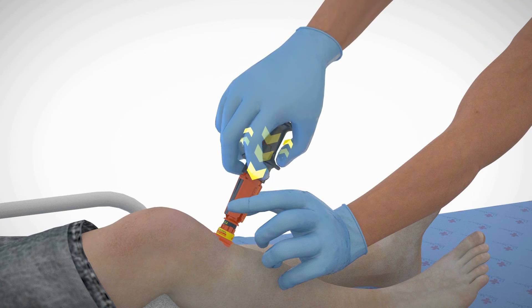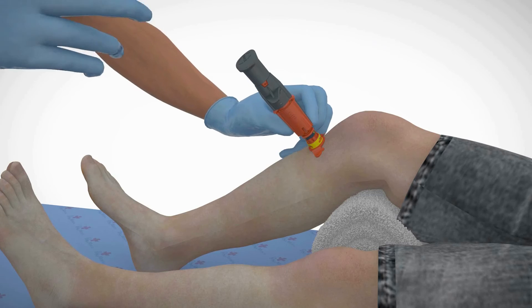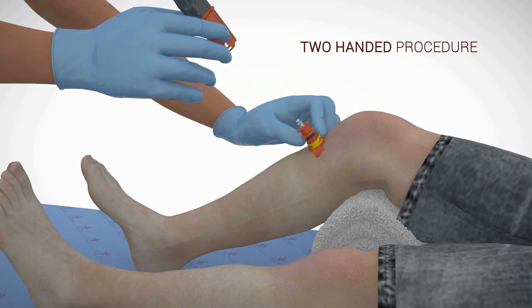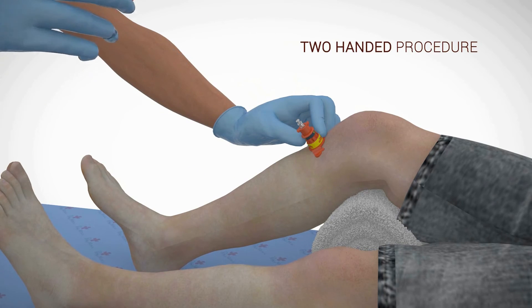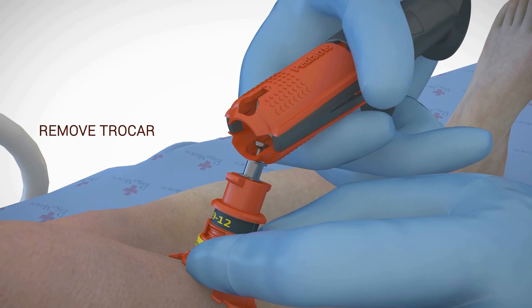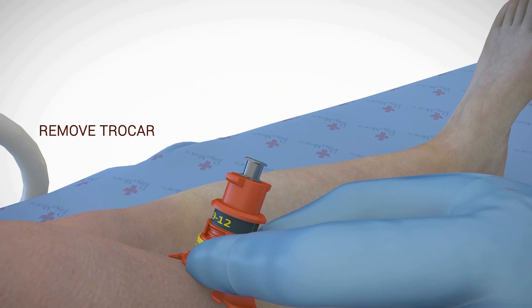Two-handed control should be maintained throughout the procedure. After activation, it is important to hold and support the base of the needle stabilizer while lifting up the device. While maintaining support and continuing to hold the needle stabilizer against the patient's skin, use the trocar removal notch to remove the trocar from the cannula.